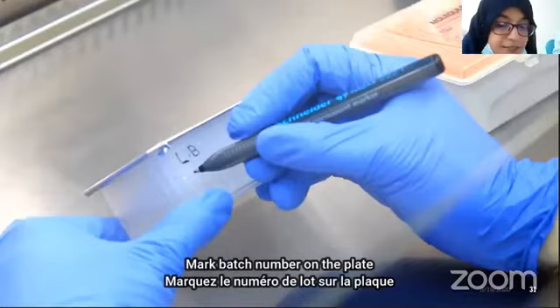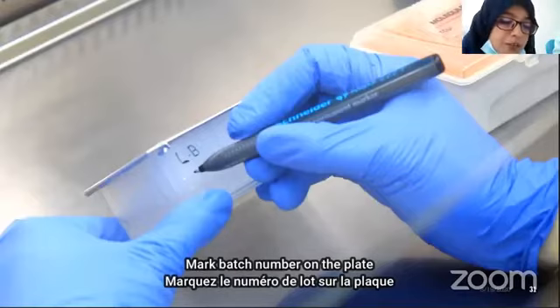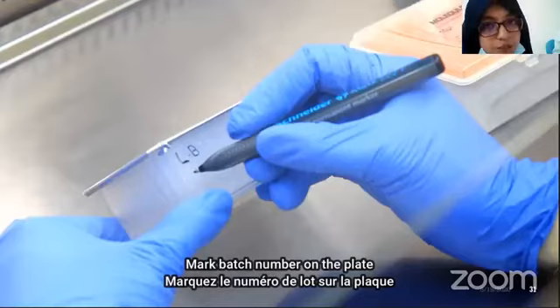This is why we are using the negative control, to check the cross-contamination. And we usually use the last 3 to 4 wells for the extraction positive control and extraction negative controls.